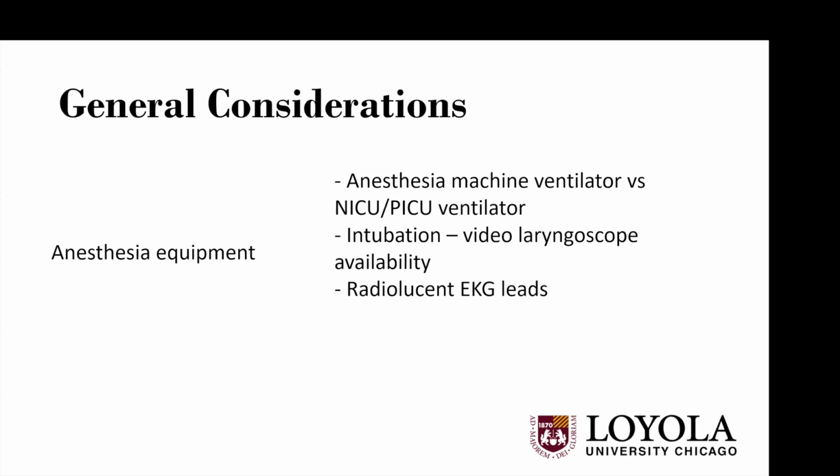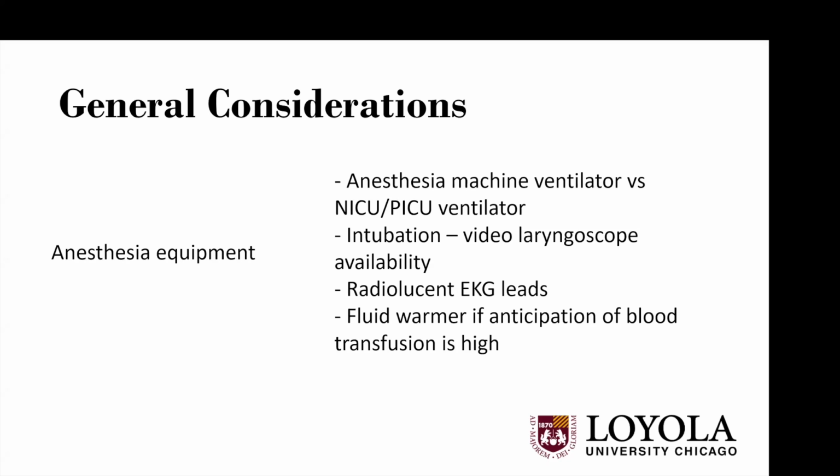These are usually available in the cath lab, and you have to remember that even if the baby comes with EKGs and other monitors on, you have to remove those EKGs, and you have to use the radiolucent EKGs in the catheterization lab. If you forget that, then you may have to do it under the drapes during the procedure, which is not an easy experience.